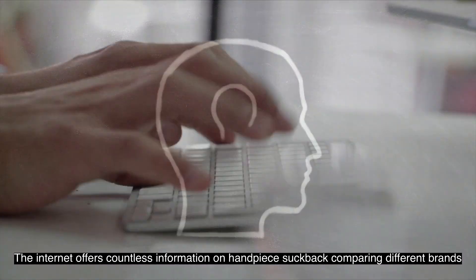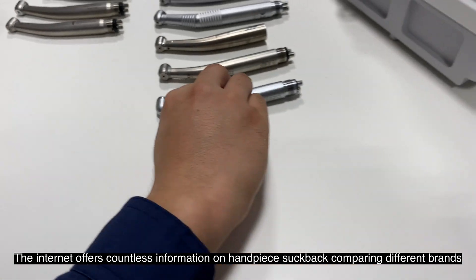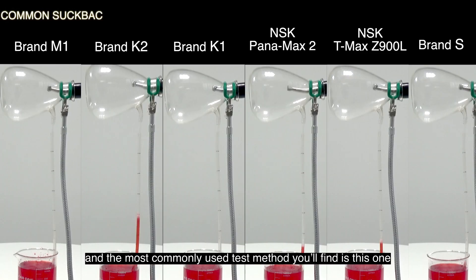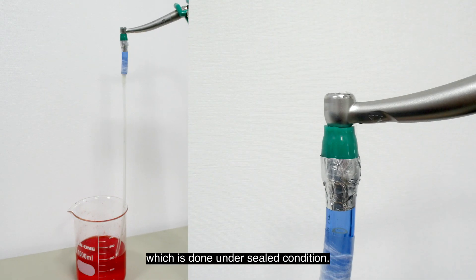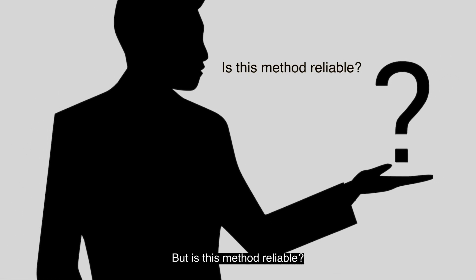The internet offers countless information on handpiece suckback, comparing different brands. The most commonly used test method you'll find is done under sealed condition. But is this method reliable?